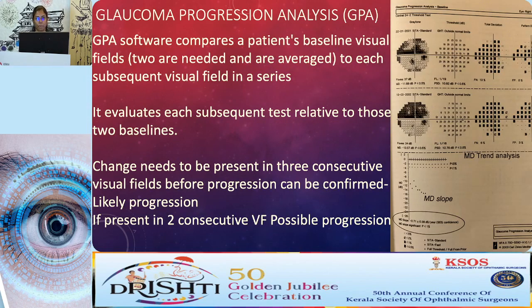This is the glaucoma progression analysis, and this has two pages. The first page is what is shown on the right side, which is the baseline fields. That is, the machine will select two baseline fields, and based on that only the subsequent fields will be analyzed. Below that you can see the mean deviation slope. This slope includes the mean deviation of the baseline as well as the subsequent fields that have been assessed, and you get a p value corresponding to that also.